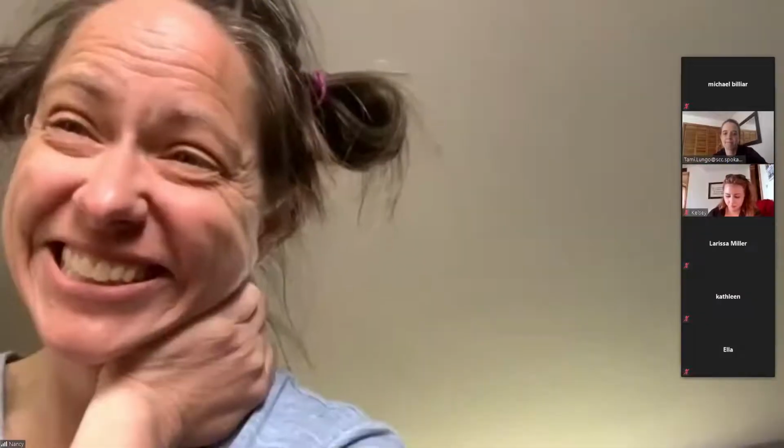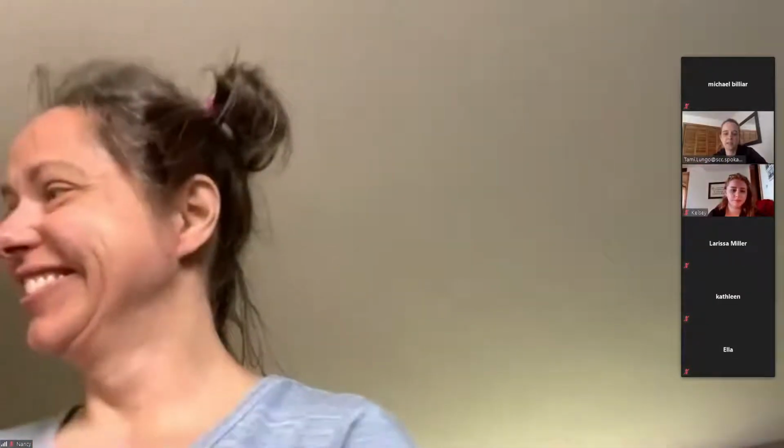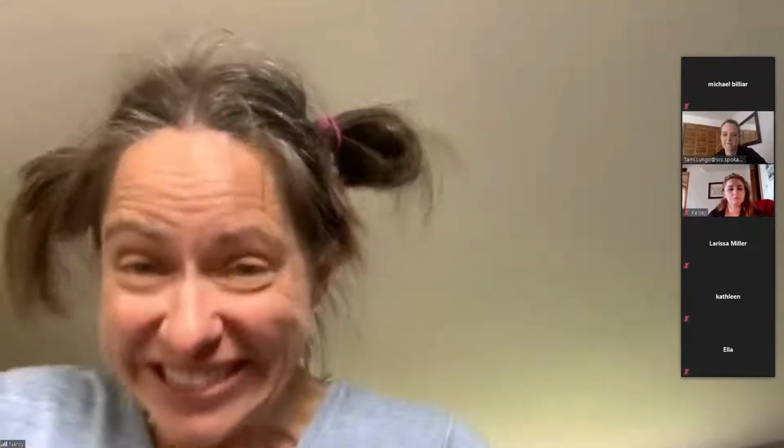Yeah. You can also do, when you guys are doing PISA, you can just drop your baseline scale and turn it down and zoom in and then do all your stuff afterwards too. You can also do TAPSE afterwards. You can drop a cursor post. If you have the picture, you can do every TAPSE and MAPSE thing you want without even having an M-mode through there. You're like, oh my God, I forgot. Drop an M-mode through it and get it done. It'll be nice to go to a lab. Yeah, machines are a little bit better then.